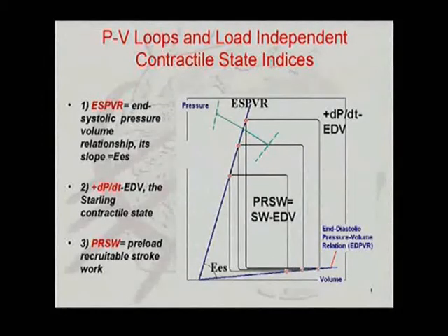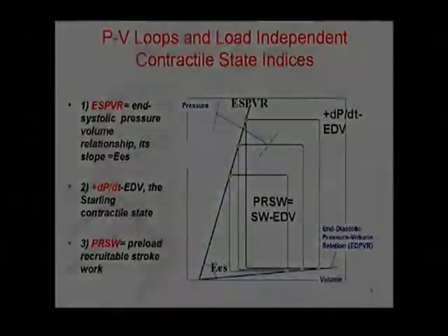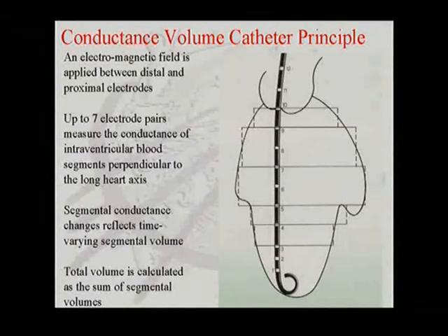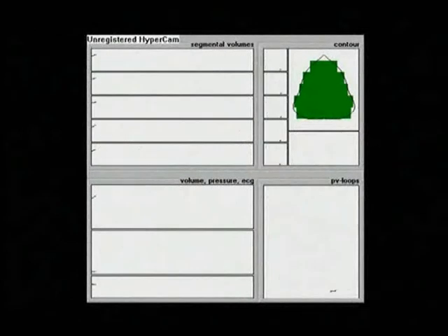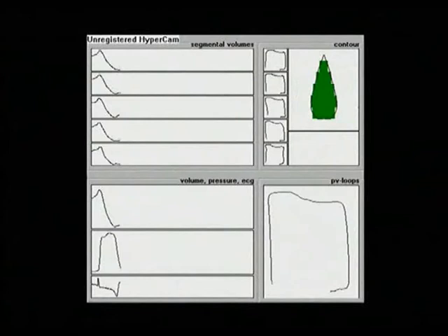PV loop allows us to evaluate load-independent contractile state indices. Seven segmental volume slices perpendicular to the left ventricle long axis are shown. In the top left panel, segmental volumes are represented. The bottom left panel shows a volume curve, a pressure curve, and the ECG recording.